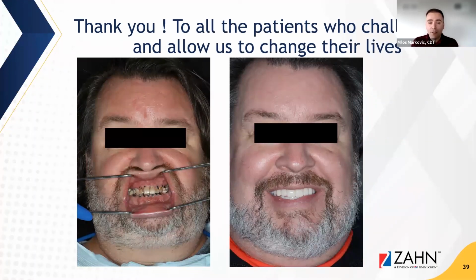But if I was to make a decision, I wouldn't go for a particular system to say this system is the best. As long as it's layered ceramic, that's what I really care about, because that's the feedback we've been getting. Our customers are saying, I want layered ceramic for pink. They don't really care which ones we use. So that's been interesting. We tried to paint on ceramics, but the detail and the light translucency and the light reflection we're getting from it is not quite there now, might be there soon, but we're definitely working on it. We're working off of a lot of feedback of what the lab owners are telling us.